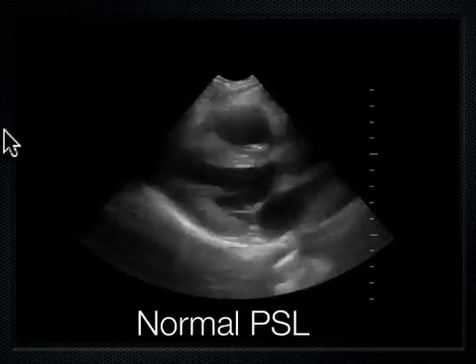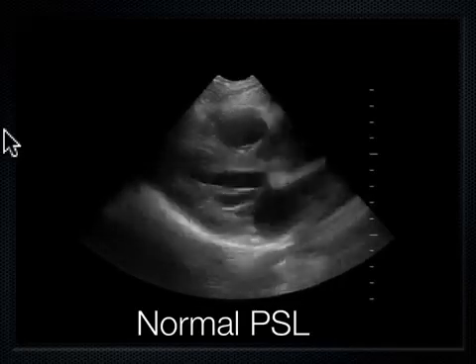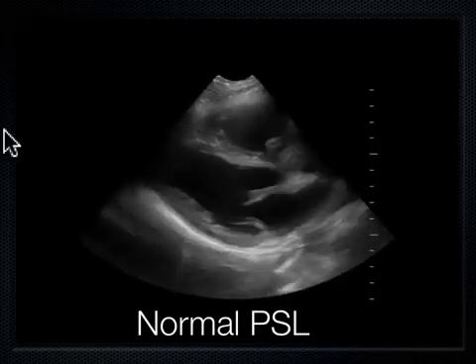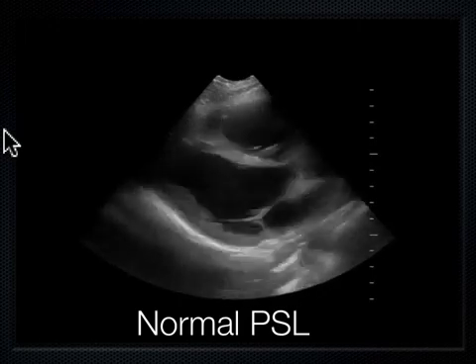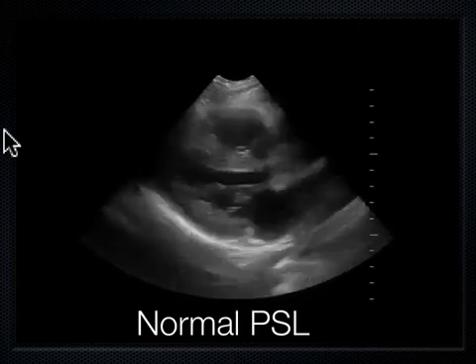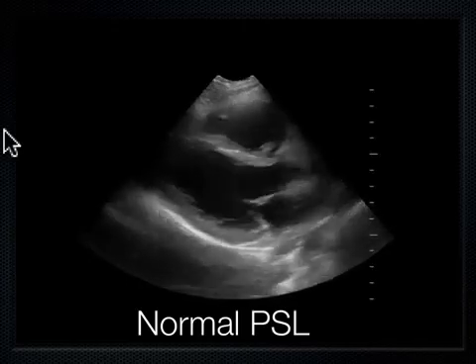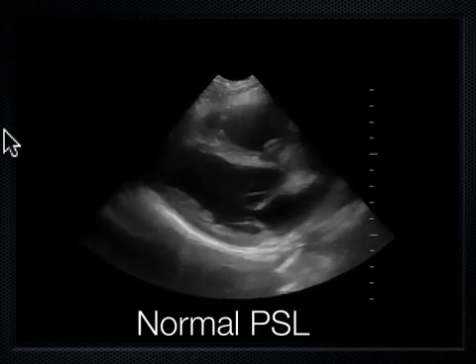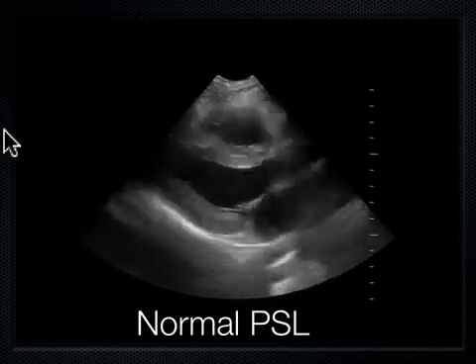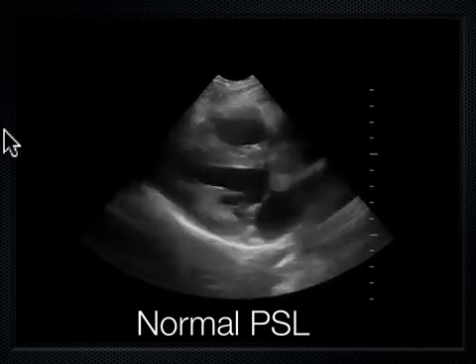And so what I do clinically is if I have a patient who's got hypotension, I am trying to resuscitate them, and I break hypotensive patients down into, do I give them fluids? If a person comes in my ER and their blood pressure is 70/40, how do I get their blood pressure back up? I can give them fluids. That's kind of my knee-jerk response. And if I saw a normal functioning left ventricle like this, yeah, I could safely give this person fluids. And that would probably fix their hypotension.